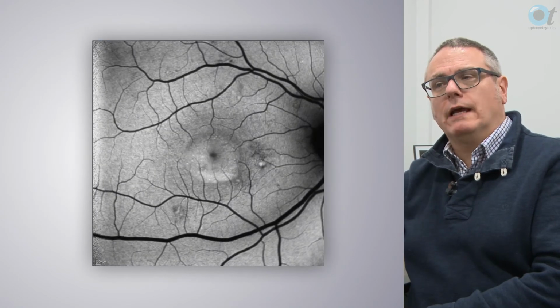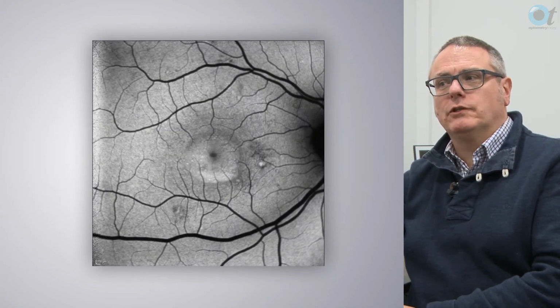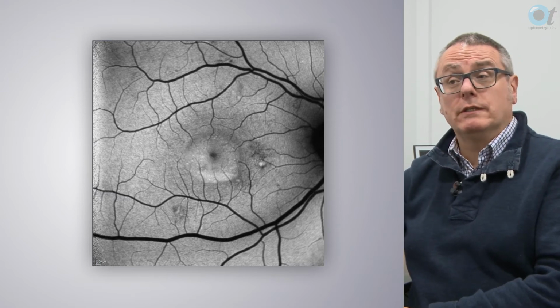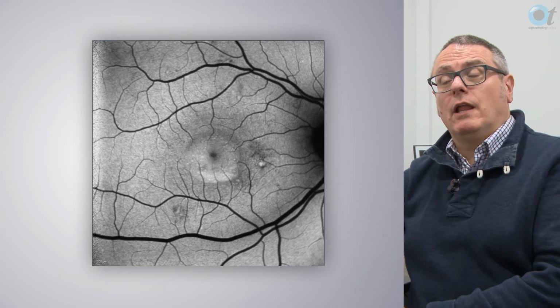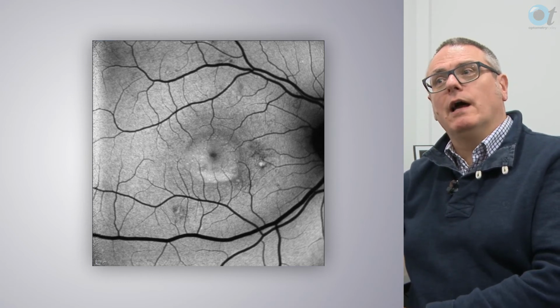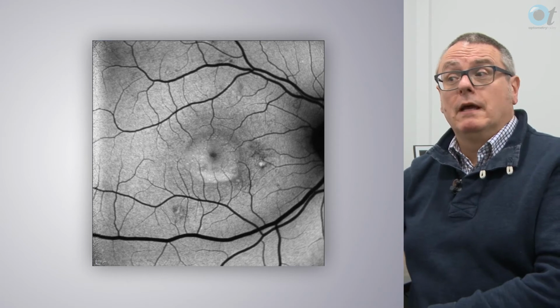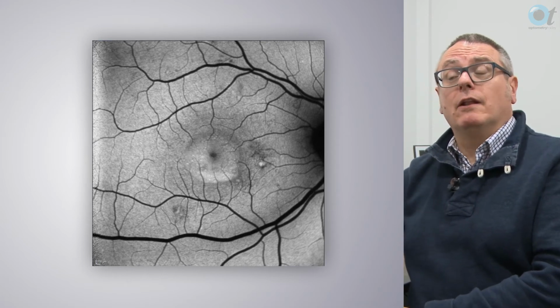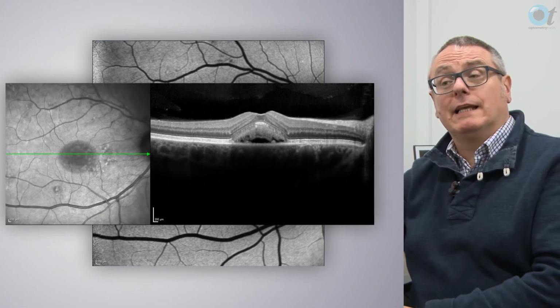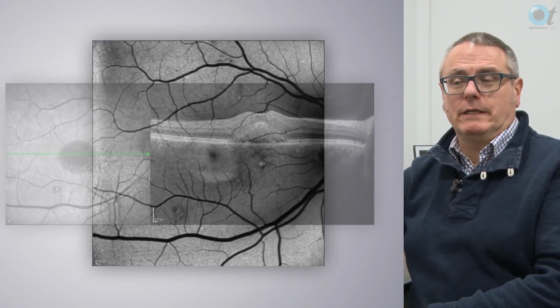If we then carry out fundus autofluorescence imaging, we can see that this image shows a hyperfluorescent region within the neurosensory detachment, and these are basically lipofuscin-rich macrophages that are being imaged using the autofluorescence procedure. So again, this implies that this is actually a long-standing problem. The thickened outer segments of the photoreceptors, appearing like stalactites, again imply chronicity.